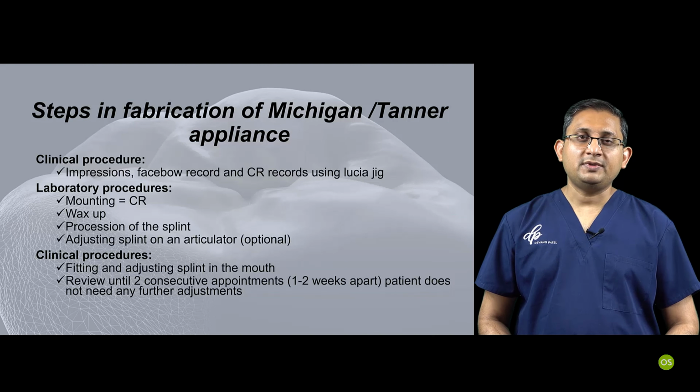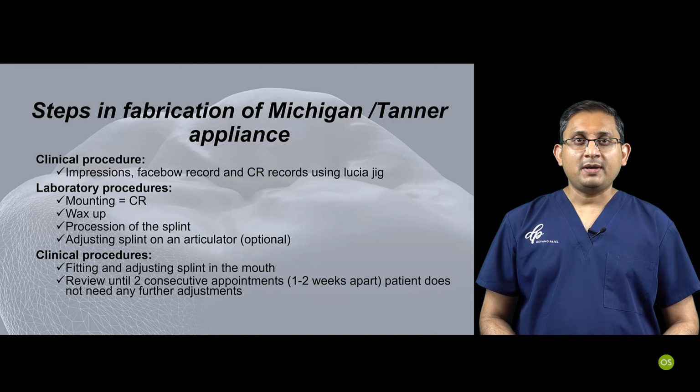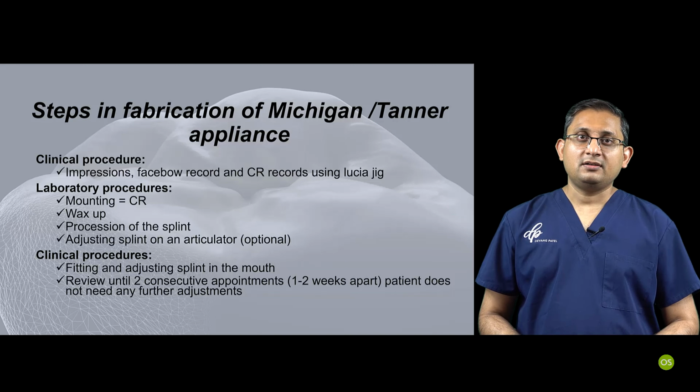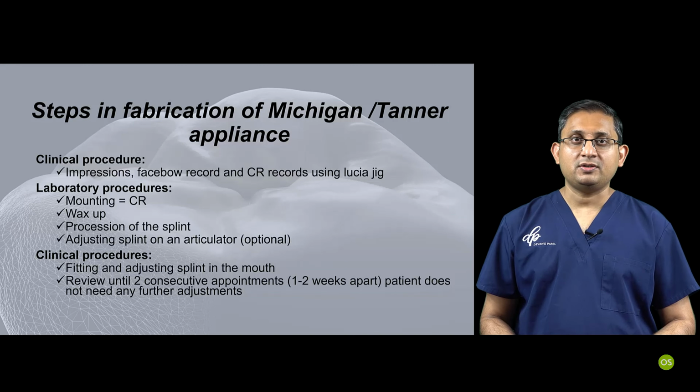However, let's assume that you are interested in assessing patients' occlusion and you would like to mount models by yourself, so then you can assess in your own practice without sending out the work for just an assessment or just a mounting. Because remember, different articulators, although it's the same articulator model, may have different progressions. They may have a little bit of difference in calibration.